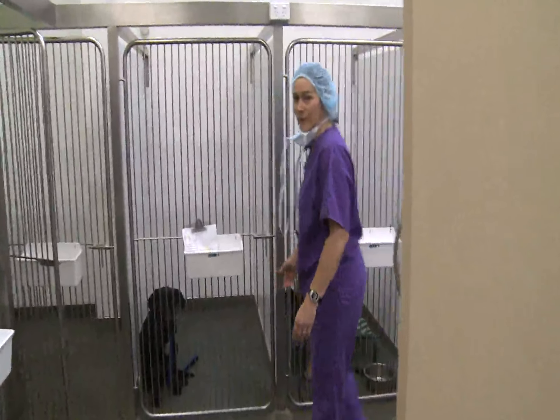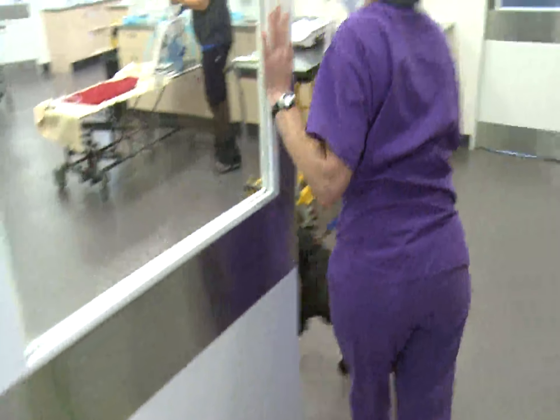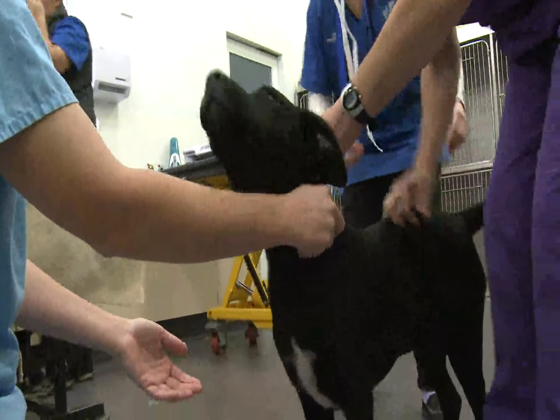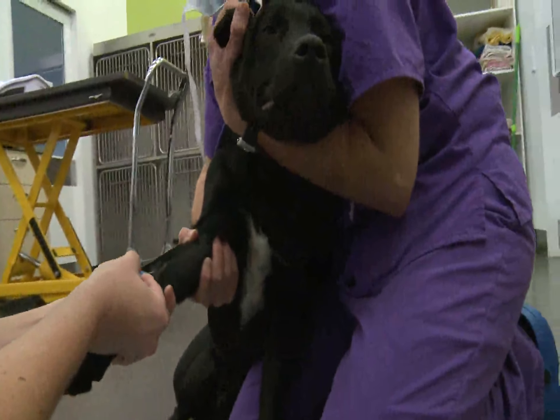The operation we're doing today is a dog neuter. There are lots of reasons why we want to neuter them. This is a really good age — this dog is about seven months. We normally neuter from about six months onwards, so if you're going to get them neutered, that's a really good time to do that.